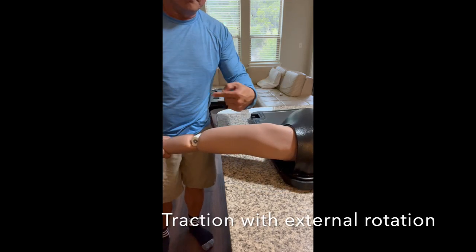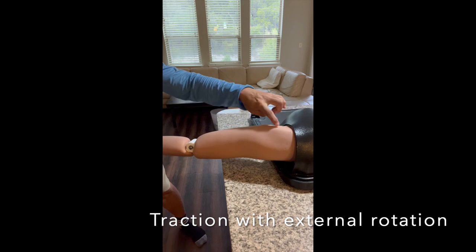Let's start with the shoulder dislocation. This simulator helps you practice the correct motion.